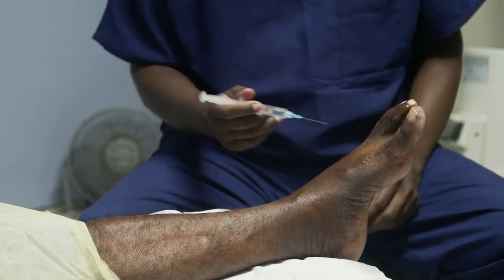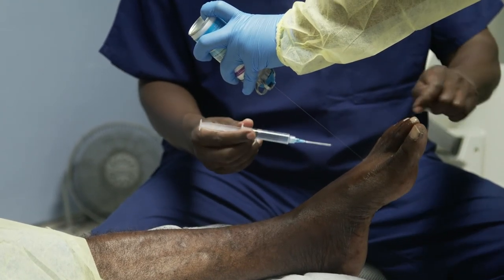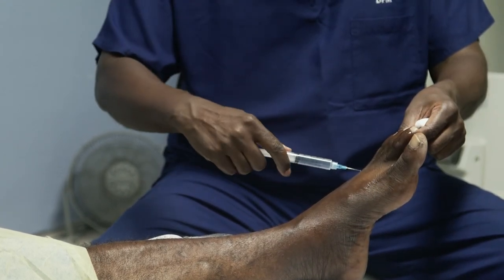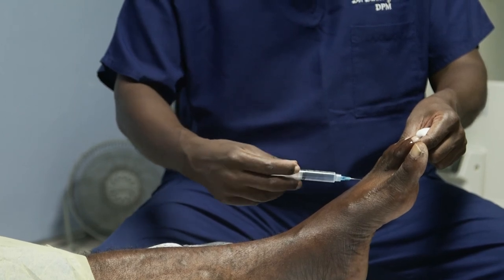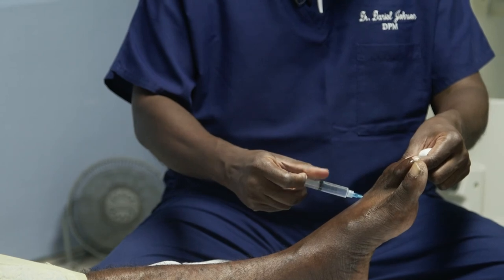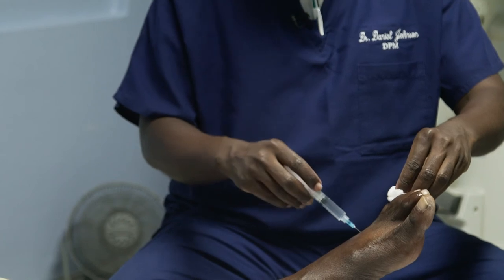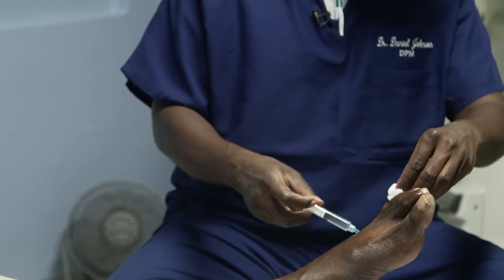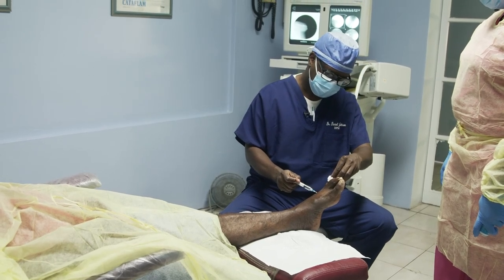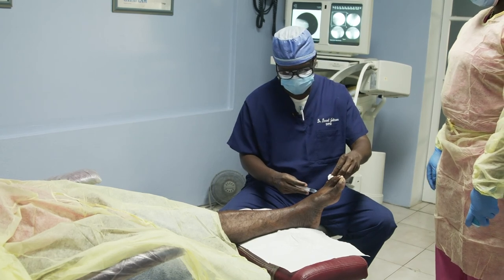Spray anyway for inflammation, a little bit there and there. So we're doing the two nerve trunks that come into the foot. Good. Got it. Pull back on that a little bit. Now the blood vessel, going right through, right into the bottom. Do you feel that? What are you feeling there? You feel that? What do you feel? You feel a little pressure? Okay. Any pain? No pain.